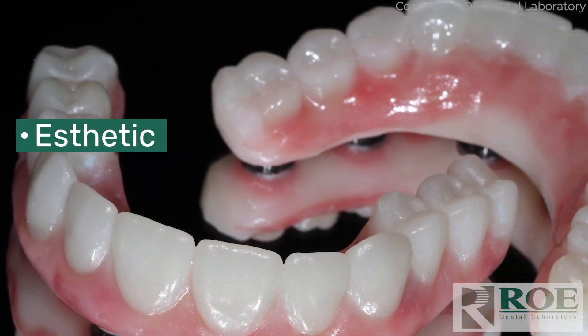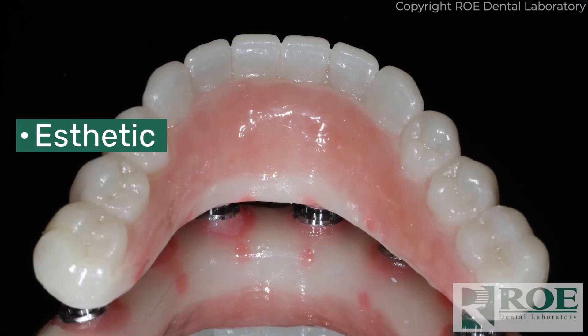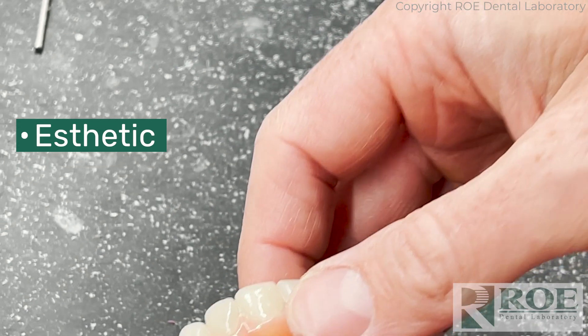What are the benefits of SmileLock? First, aesthetic benefits. There's no holes in the prosthetic, so it's a prettier looking prosthetic. It can actually be thinner. There's also mechanical benefits.